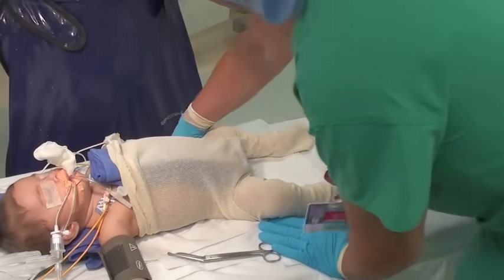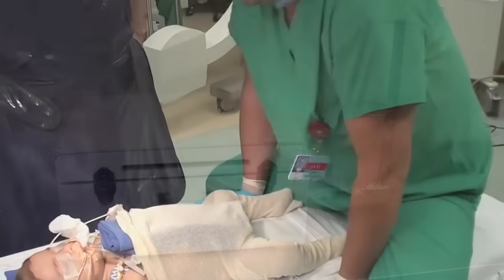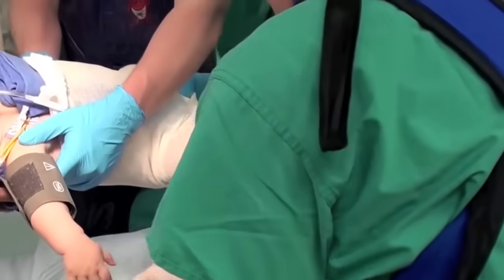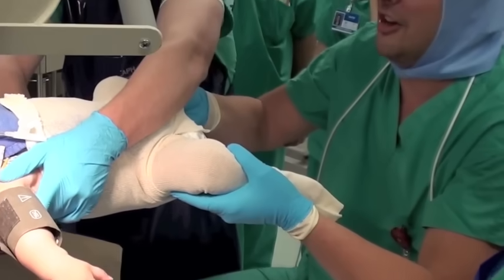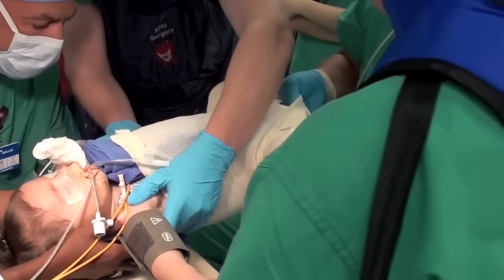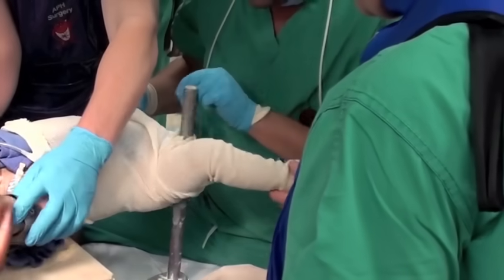First, the child is wrapped in a liner that helps absorb moisture. Then this box is used to gently lift the baby onto the box with this pad, this little metal piece supporting the buttocks. This allows the cast to be wrapped around the body.